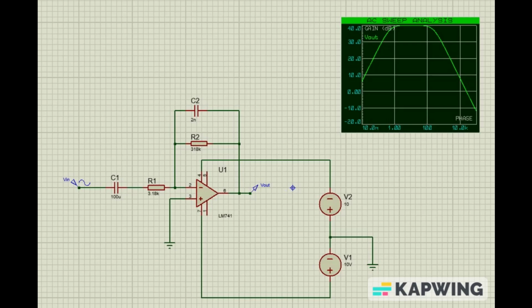So how does the band-pass filter work? In the circuit, we have chosen two resistors and two capacitors to filter out unwanted frequencies. The values are chosen so that the filter only allows signals within the desired frequency range to pass through, while also amplifying the signals by a factor of R2 divided by R1. In this specific circuit, we have chosen R1 to be 3.18 k ohm and R2 to be 318 k ohm.